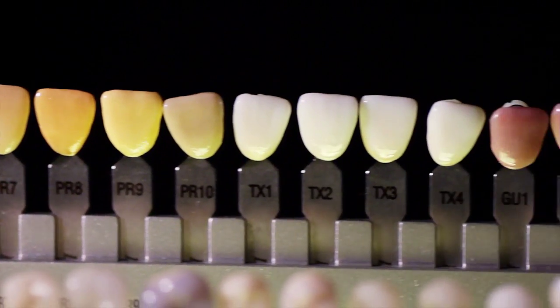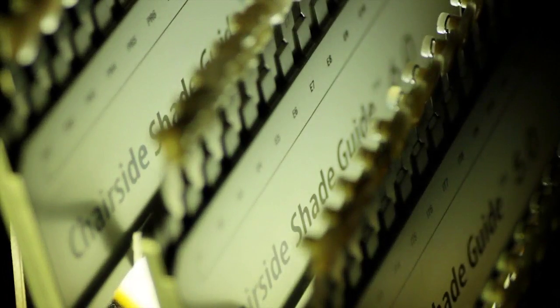The seasons of life cannot be stopped or changed, but they can be recreated naturally and beautifully with Seasons of Life shade tabs.